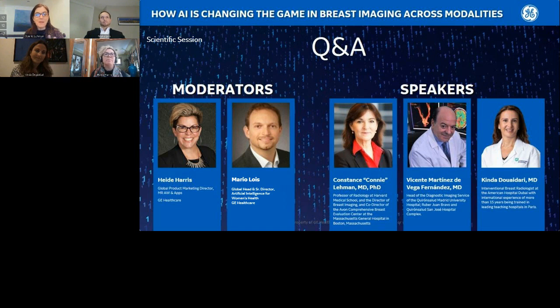I'm seeing amazing rigor in how people are developing, training, testing and validating their models internally. That area, I see a lot of people doing great work in, but we're not seeing that same level in external validation and what we mean by true external validation. And we certainly haven't begun to see any level of real scientific rigor in studying carefully, once these tools are clinically implemented, how they are improving the outcomes of our patients.